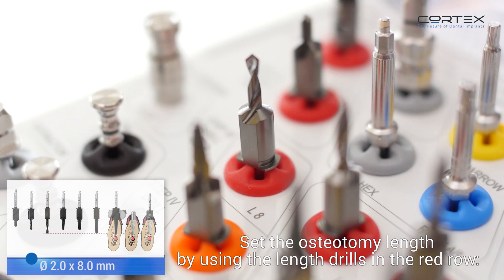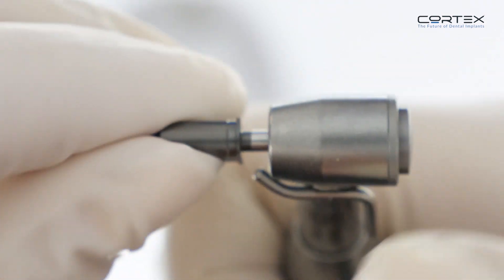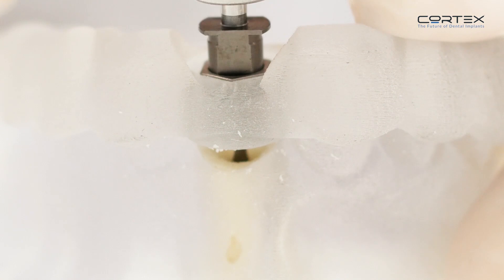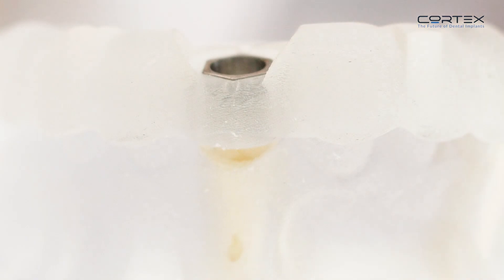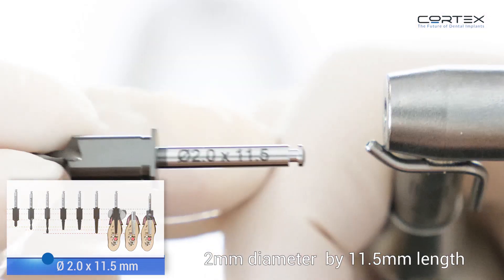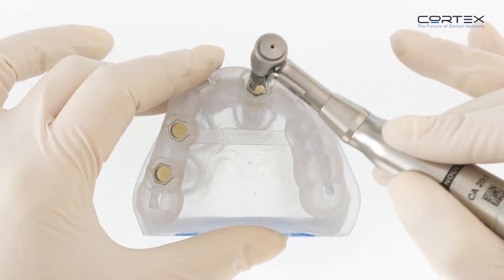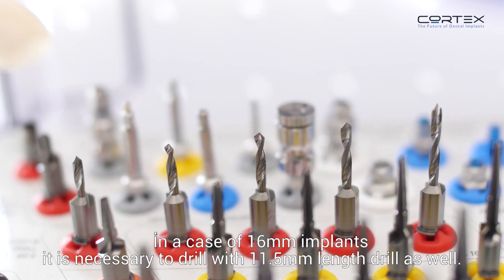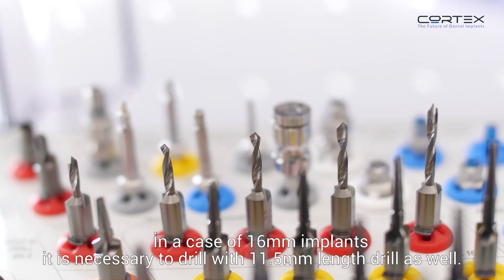Set the osteotomy length by using the length drills in the red row: 2mm diameter by 8mm length, then 2mm diameter by 11.5mm length. In the case of 16mm implants, it is necessary to drill with the 11.5mm length drill as well.